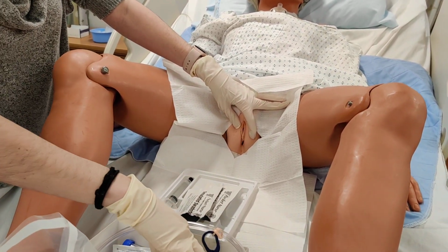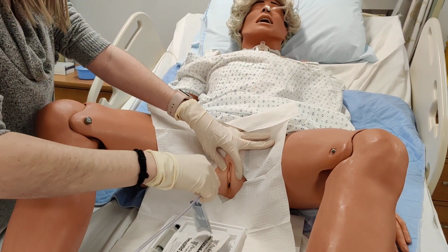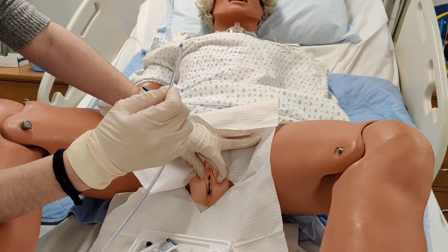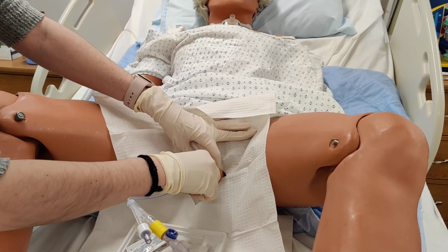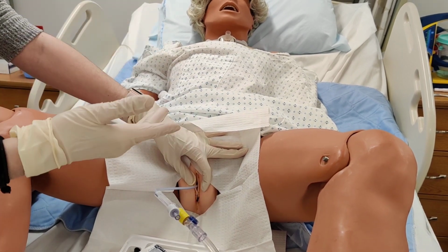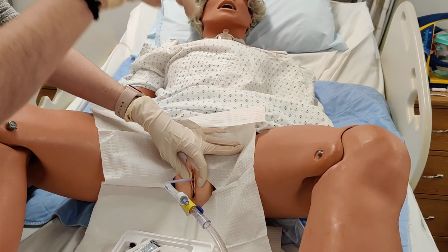So once she's gotten to that point, she's going to take the catheter, work the packet off of the loop, and then she's going to insert the catheter into that meatus. I'm going to ask my patient to bear down for me. And I'm going to wait until I see urine return. I'm obviously not going to see it on the mannequin, but when I do, I'm going to advance my catheter 2.5 to 5 centimeters more. And she's going to hold that in place.